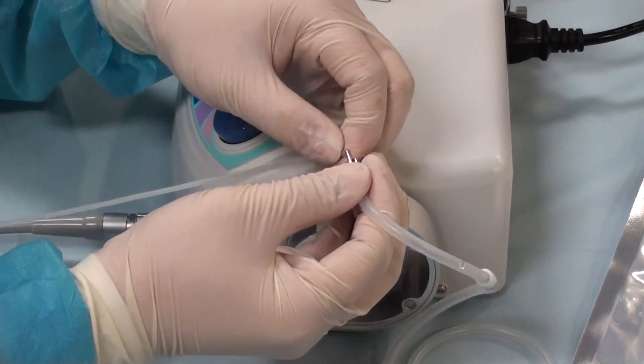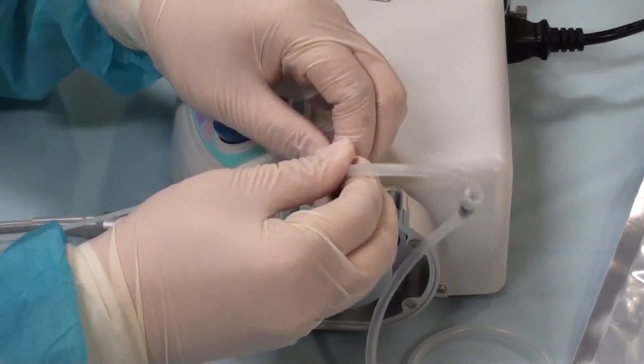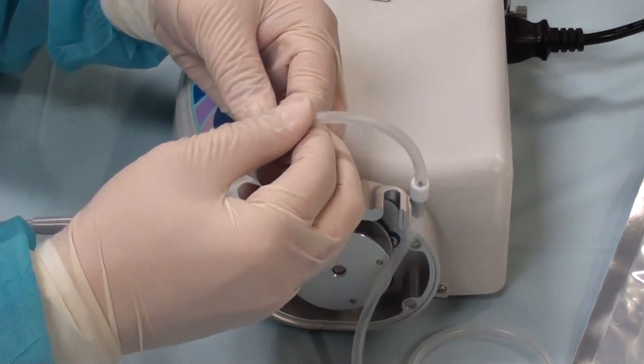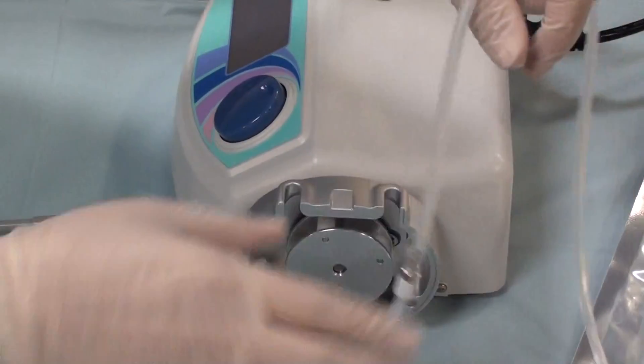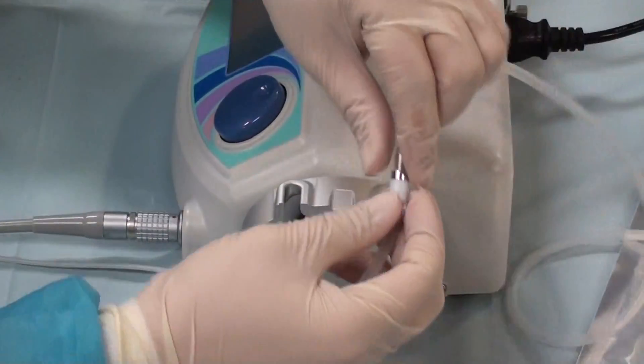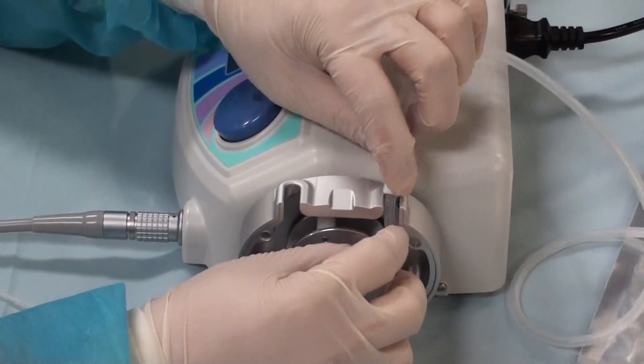Get the nipple end into the hole nice and tight and put it in. Then with the other side — the side with the spike — you want to put the tubing into the housing.